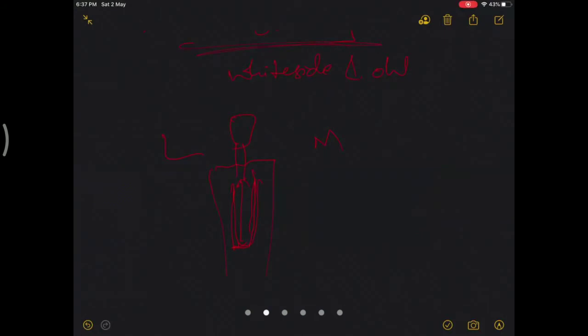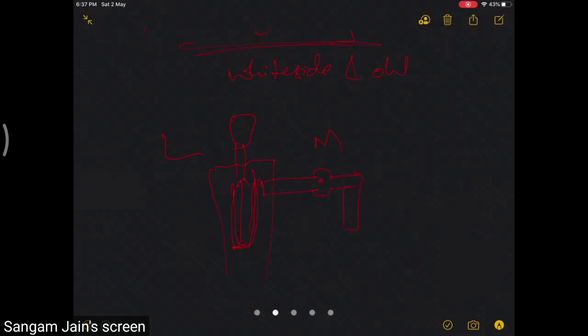So what you will do, you will take a saw here. Okay, so you will saw it out through and through, but you will not dissect on the lateral aspect. And people have said you make a rounded edge so that it doesn't act as a stress riser. And preoperatively, you can make drill holes if you are not planning for advancement or proximal slide or distal advancement.